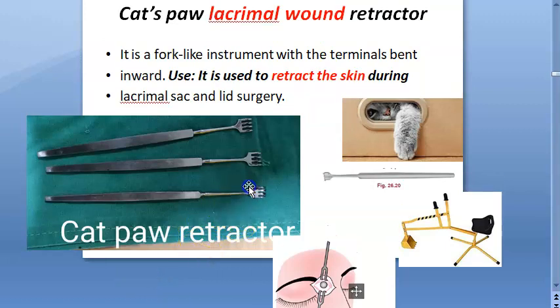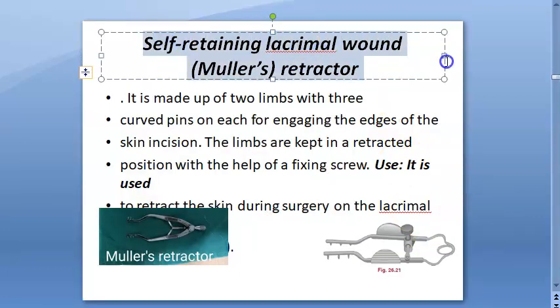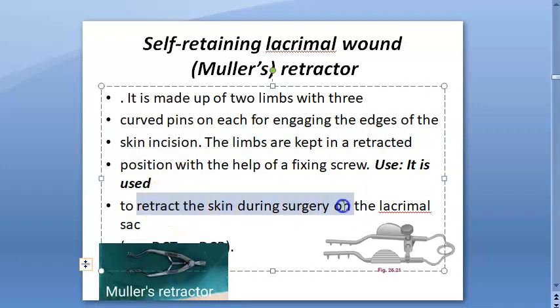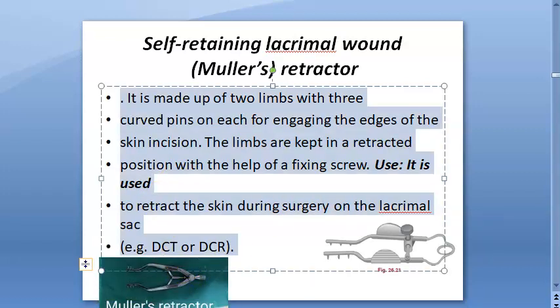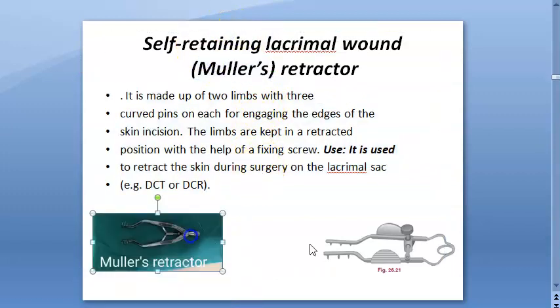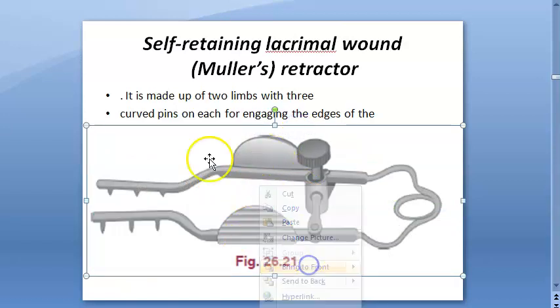Look at this — somebody has to hold them apart, right? But there is something which can hold itself. This is a self-retaining lacrimal wound retractor. It is used to retract skin during surgery on the lacrimal sac, like in DCR or DCT procedures. This is Muller's retractor, and it is also very sharp.